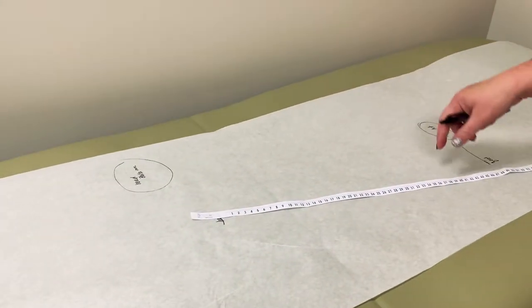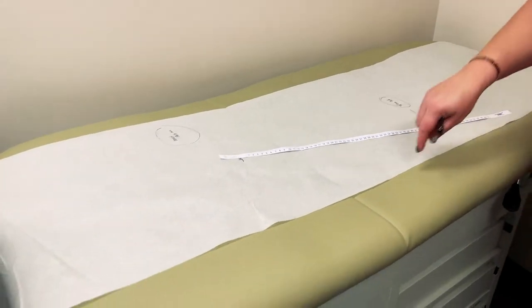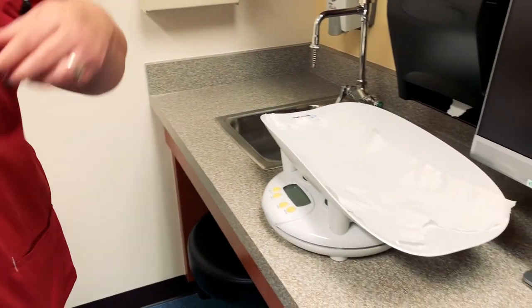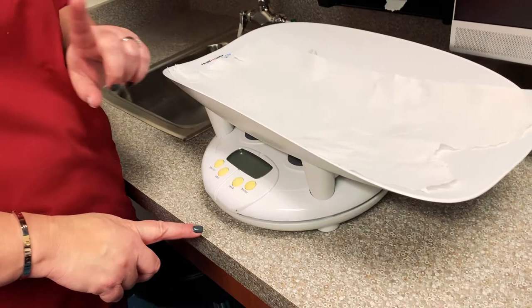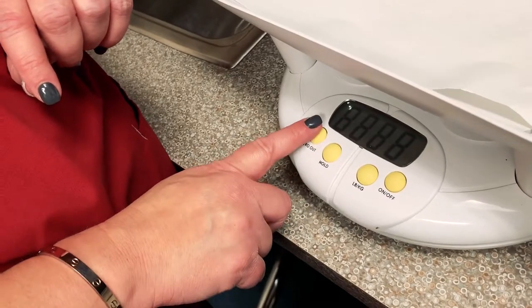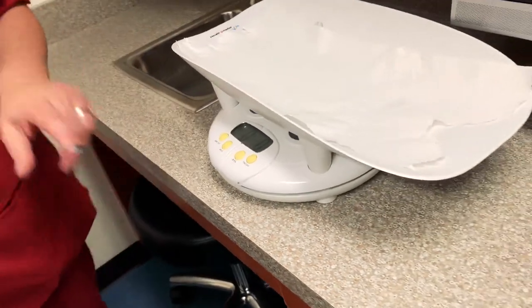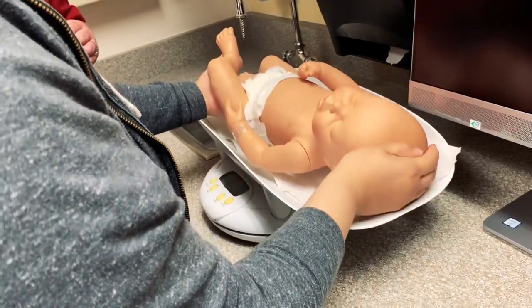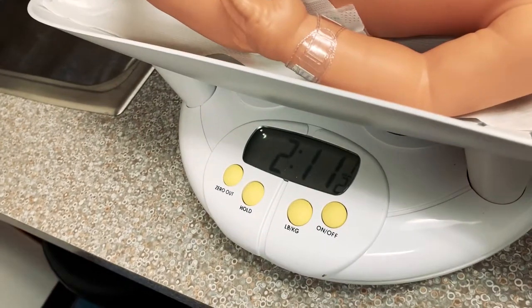We'll come back to those when I go to plot the baby's growth on the chart, which you'll see in another video. You want to make sure that you're weighing the baby in a diaper, and it's really important to remember that you zero out the scale so that it starts with complete zeros. Most of the time that happens automatically, but always important to double check. Then have the mom or dad place the baby carefully into the scale and wait for the scale to do its thing.